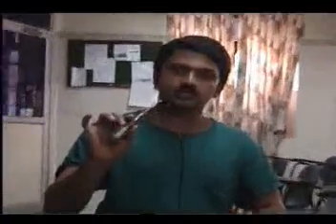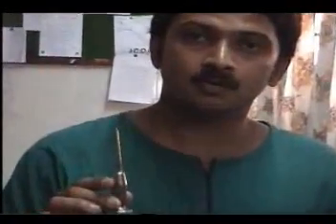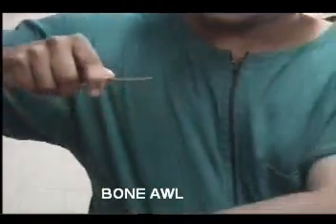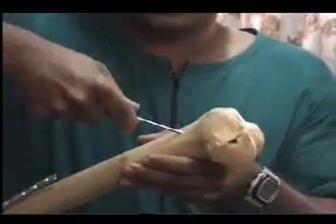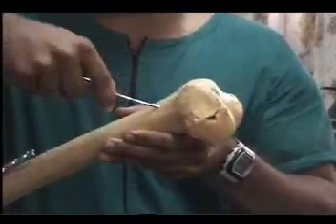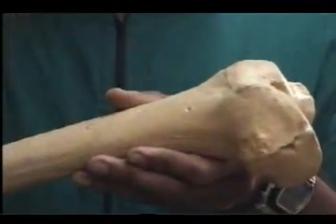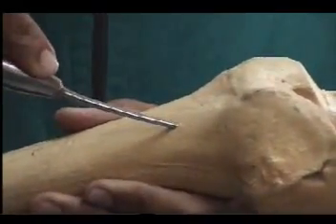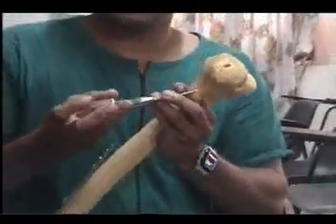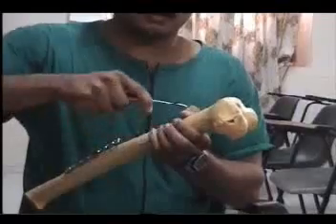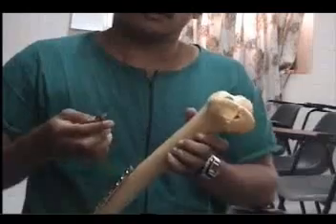This instrument is called the awl — A-W-L. Even though it looks sharp, the awl is usually blunt. It is held by the hand, pressed onto the bone wherever you need to make a hole, and turned in a series of movements to make the desired hole. Once the hole is made, instruments such as a nail or wire can be passed through it. The awl has a pointed end and a large handle for holding and introducing. It is commonly used for making holes in the cortex for radial or ulnar nails.